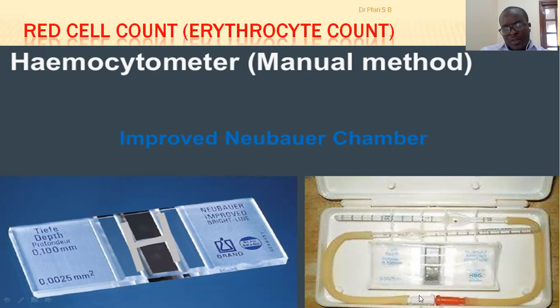For the white blood cell, it's white. Then when you check the bulb here, the bulb for the red blood cell is bigger, and the bulb for the pipette of white blood cell is smaller. When you check inside the bulb, you have a bead structure, a bead. The bead found within the pipette of red blood cell is red. That of white blood cell is white. You can't appreciate it here because of the contrast.